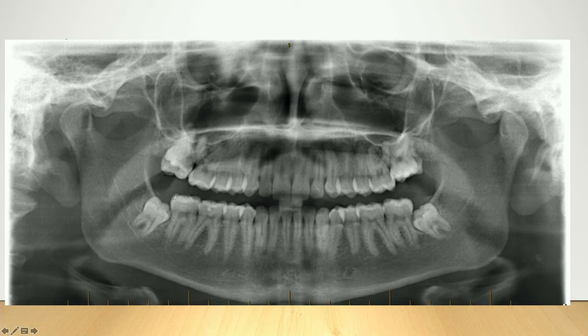So I really need to get into this area so that I can, A, section the tooth, and B, remove and gutter buccal bone. Therefore, I'm going to make life easier for myself, and I would do a mesial relieving incision to give me plenty of access to get to this tooth, because I know it's a difficult tooth to remove.